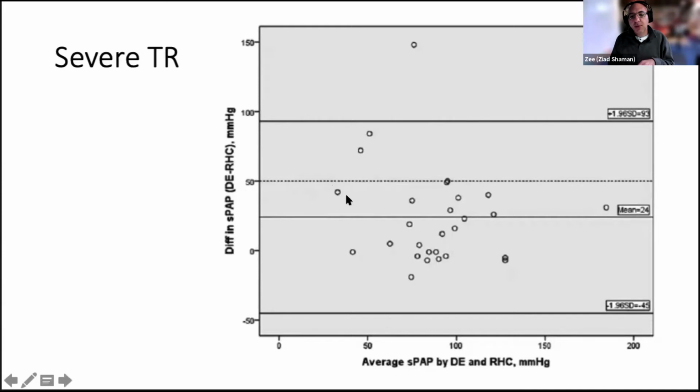Because using continuous wave Doppler, you don't know where you're measuring, you just know what's the fastest speed. I haven't come across anybody recommending using pulse wave Doppler in this situation, but it might be interesting to try. So the answer is really, it's not the right atrial pressure, it's the Doppler echo measuring that transvalvular gradient. Does that answer the question?